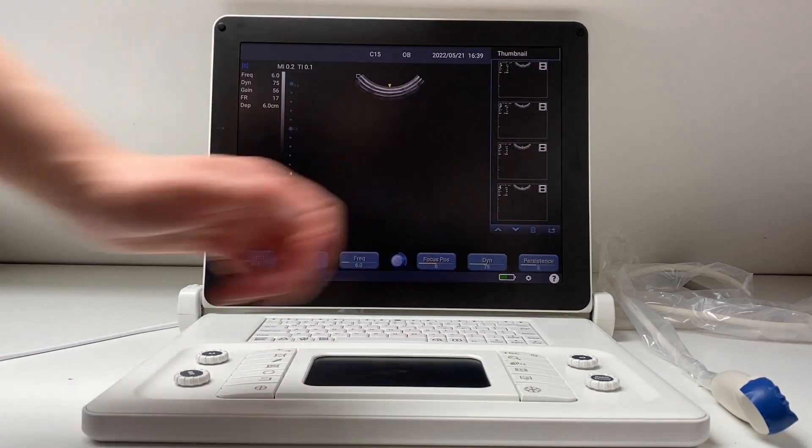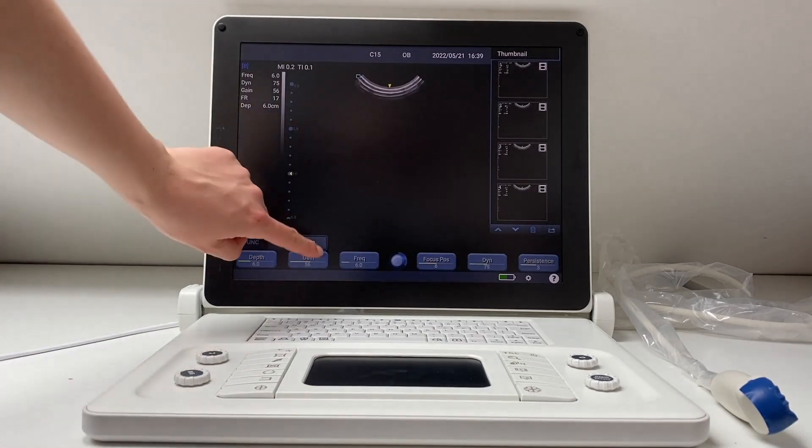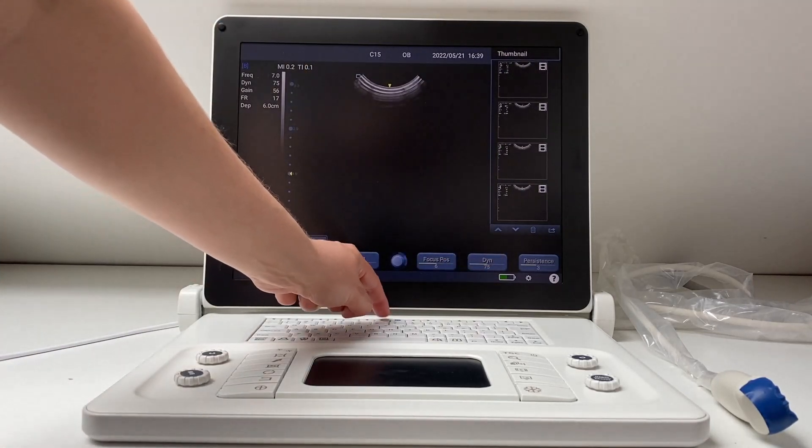Secondly, there is no longer a touch screen. If you have used a scan pad all your scanning life, your instinct will be to touch like this, but you will have to get used to adjusting with these arrows down here.